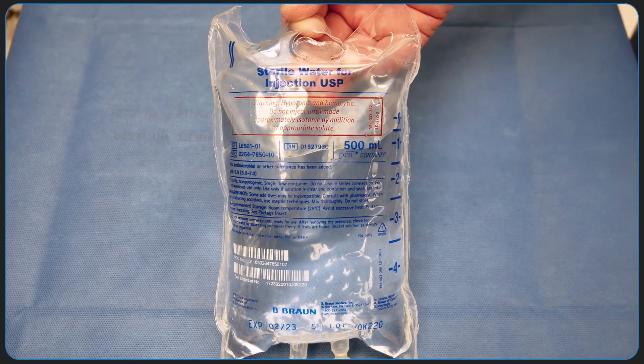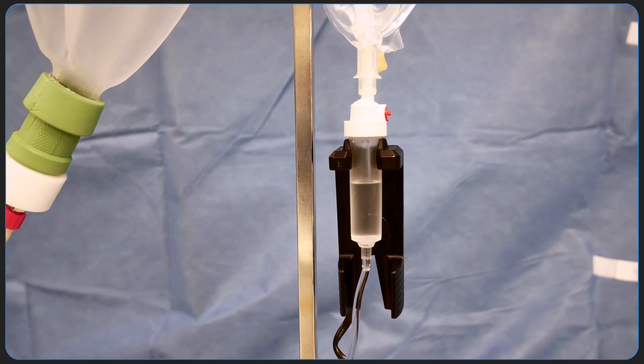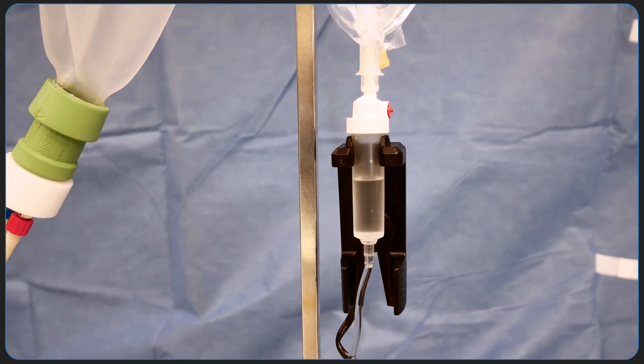Sterile water should be used for humidification. Using saline has the potential to damage the vaporizer unit inside the apparatus and cause harm to the patient's airway.